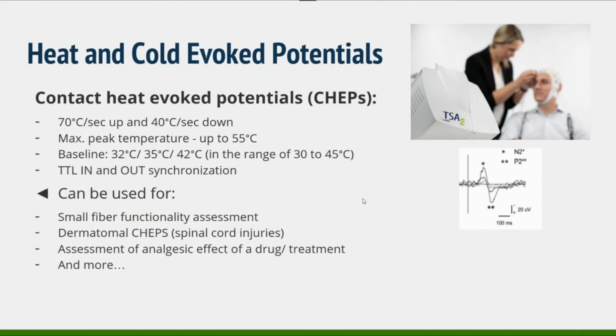Another potential application of CHEPS, of contact heat evoked potentials, is what is called dermatomal CHEPS. The group I already mentioned today, a wonderful group in Switzerland, led by Professor Armin Curt. They developed this technique that is called dermatomal CHEPS.